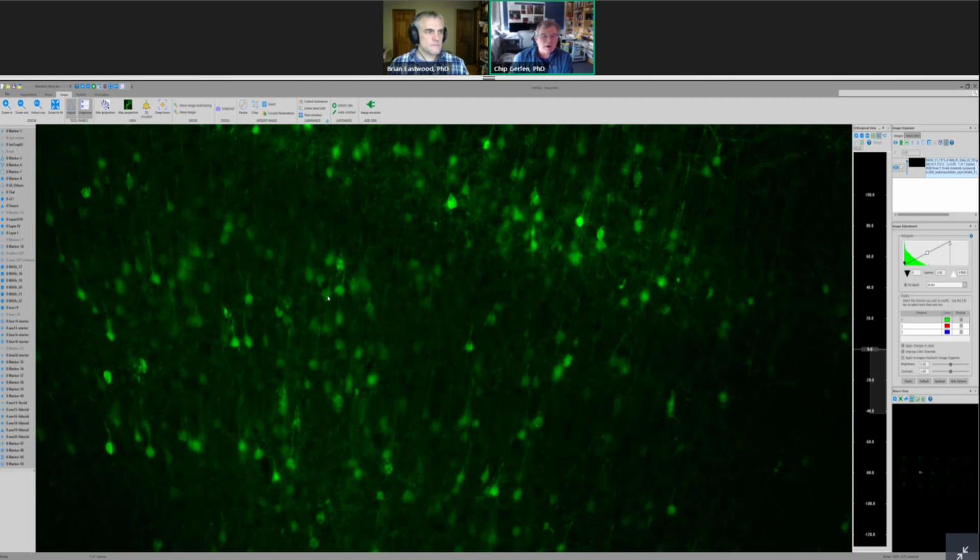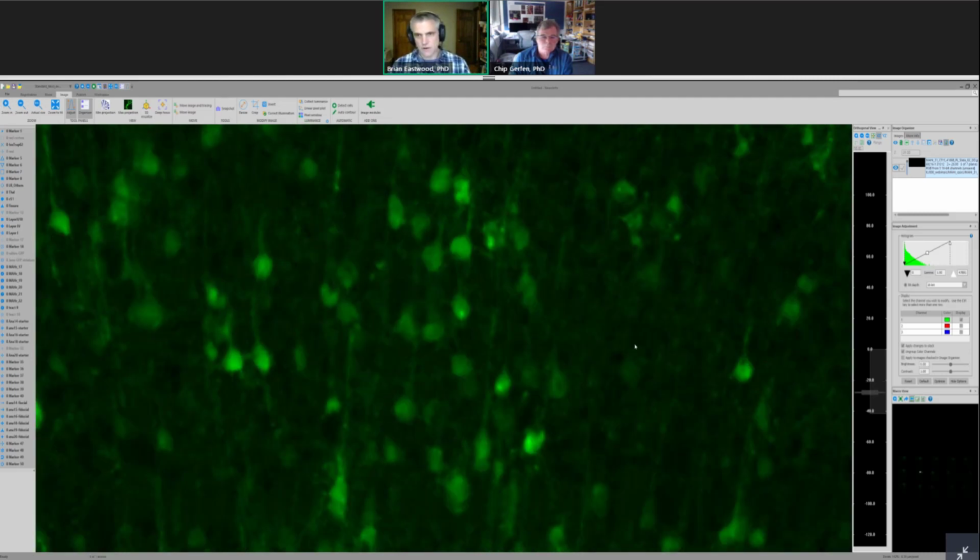So this program incorporates an algorithm that we call deep focus. And Brian's going to describe this. Sure. So the deep focus is a projection technique that shares some similarities to a maximum intensity projection. But instead of taking the maximum intensity at a particular location through a Z-stack, we analyze a focus metric everywhere in the image, within all planes, everywhere on the slide. And then for every position, we preserve the intensity for the plane that has the maximum focus score. And we do that across the entire slide. And so the result is a 2D image, a projection, where everything is in focus.